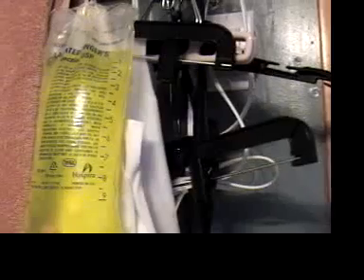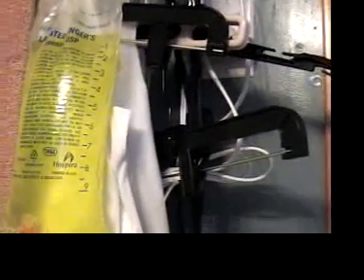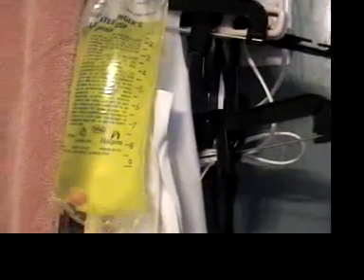Afer gets 50 milliliters twice a day, so I will be going about halfway between the 0 where we are now and the 1. If I had used a new line, I would have used up more fluid to fill up the line, so it would be lower down and I may be going to almost the 1. But in this case, I'm just going to go about halfway to the 1.